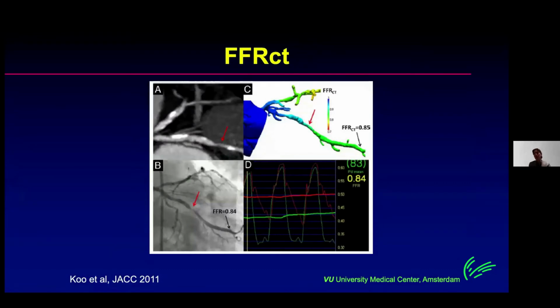A lot of people then ask, well, what about these new computational model algorithms like FFRCT to enhance the diagnostic accuracy of CT?